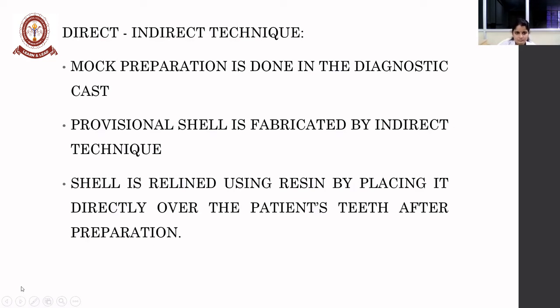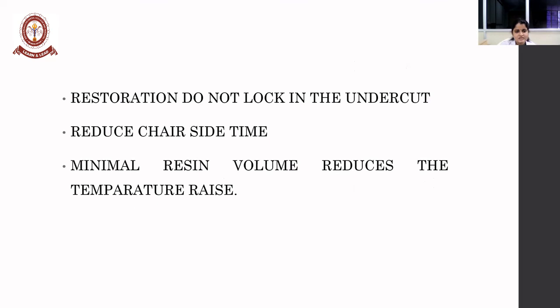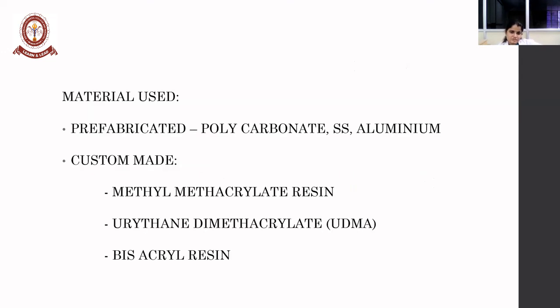That is, the shell is relined using resin by placing it directly over the patient's mouth, the same thing which I have explained earlier. Next, the restoration should not lock in the undercut, which reduces chair side time. Next is minimal resin volume, which reduces the temperature risk.